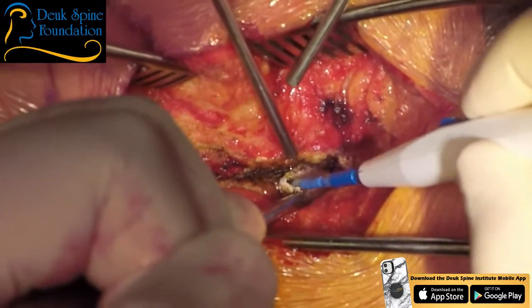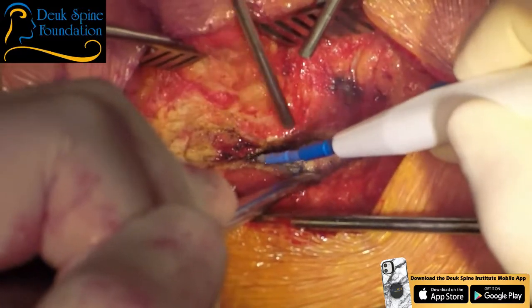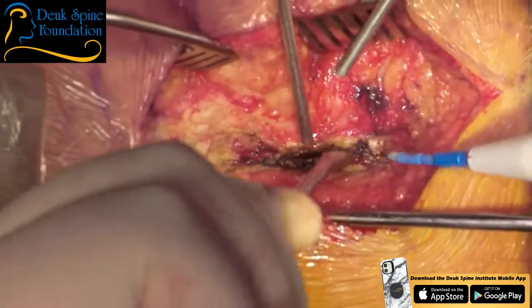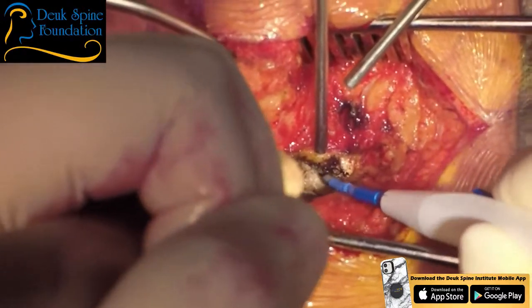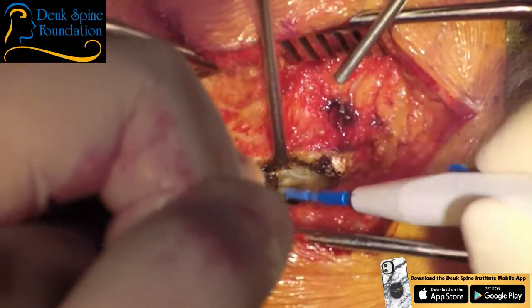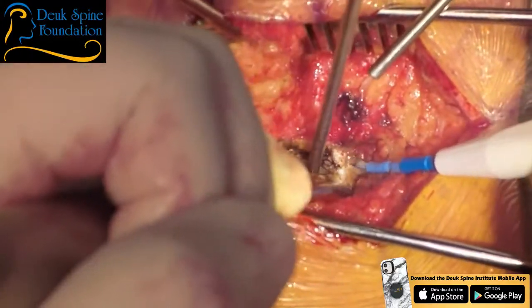We need more muscle relaxation, please, Dr. Fu. So I would give her more now and then let it wear off, but I need it mostly in the beginning. I like the muscles to be isoelectric, meaning when I bovie next to them, and we don't need a lot, Dr. Fu, just a little bit. When I bovie next to them, I don't want to see them contracting. Most surgeons don't pay attention to that. But the reason for that, there's several reasons I like that.